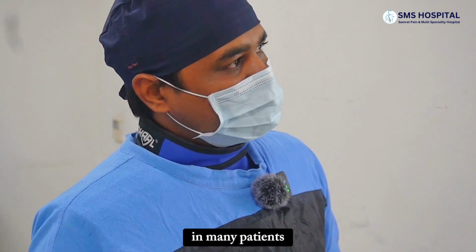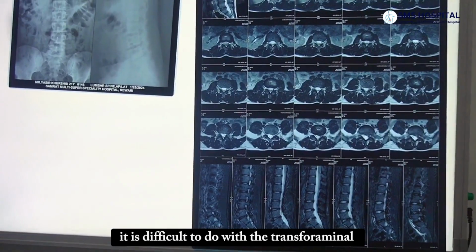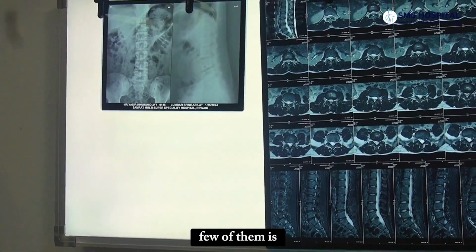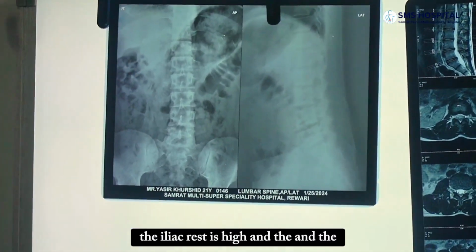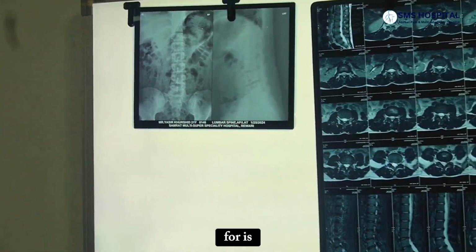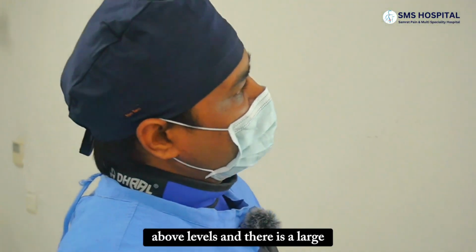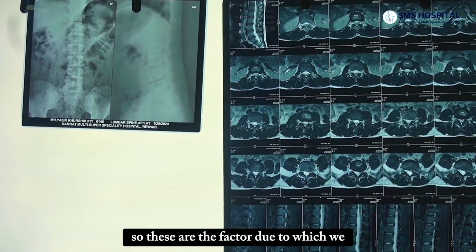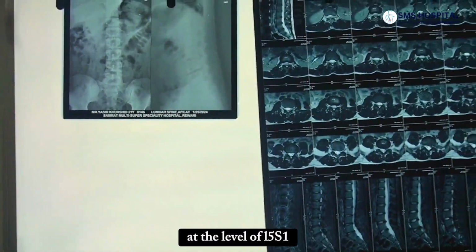In many patients, if there is L5S1 level disc prolapse, it is difficult to do the transforaminal endoscopic discectomy because there are many factors. A few of them: the iliac crest is high, the aperture of the transforaminal foramen is smaller compared to the above levels, and there is a large transverse process. So these are the factors due to which we feel difficulty while doing the transforaminal discectomy at the L5S1 level.